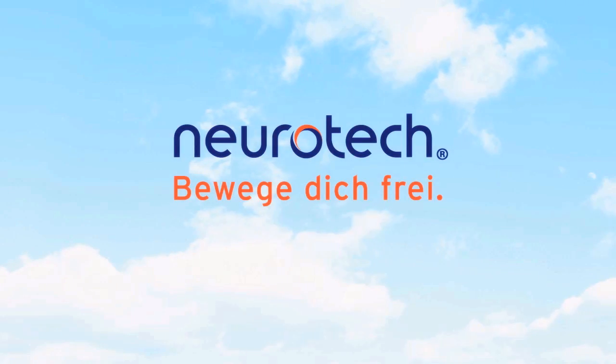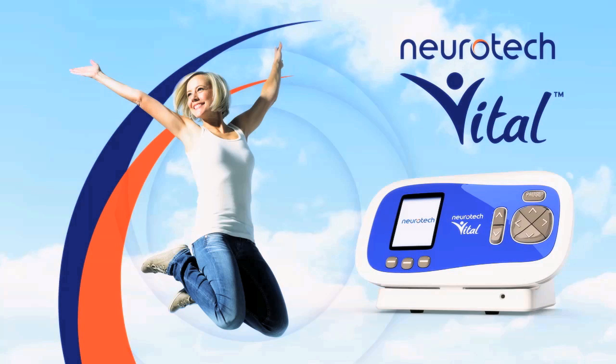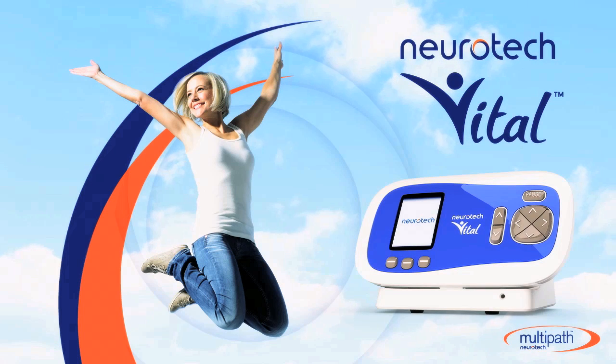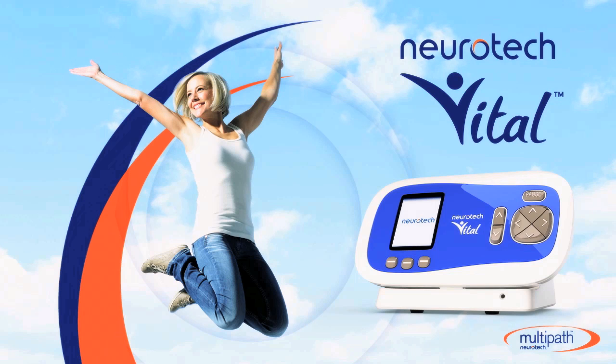Thank you for choosing Neurotech Vital. This video will help you to set up and begin your treatment with Neurotech Vital. Your clinician has prescribed the Neurotech Vital to treat your stress incontinence. Neurotech Vital is a device that delivers neuromuscular electrical stimulation to help your pelvic floor muscles to activate and strengthen. We'll show you just how easy it is to use the Neurotech Vital.